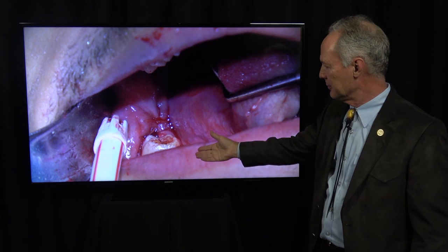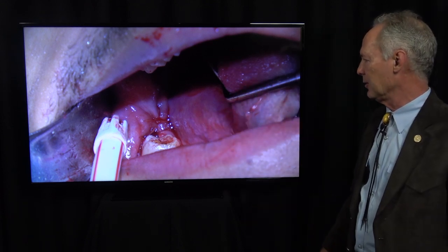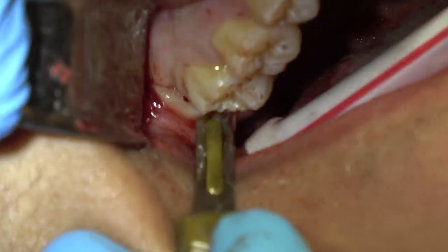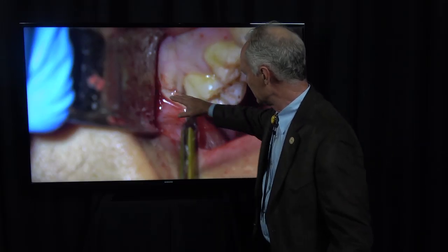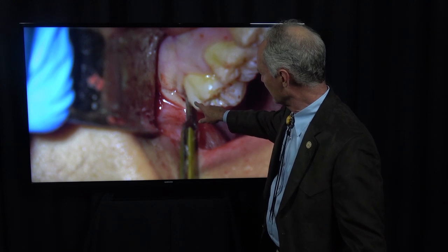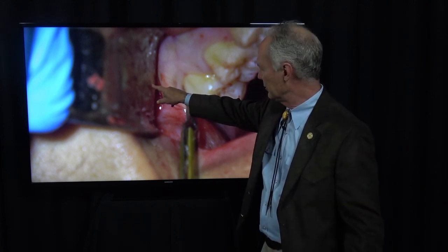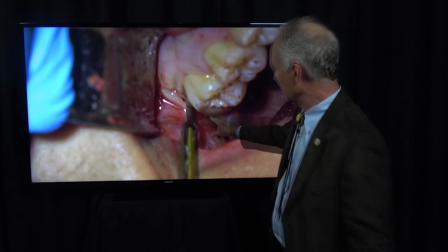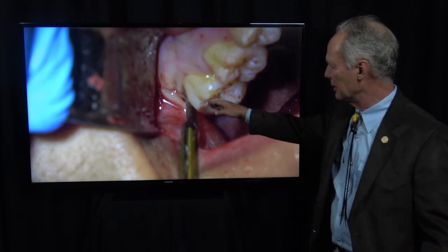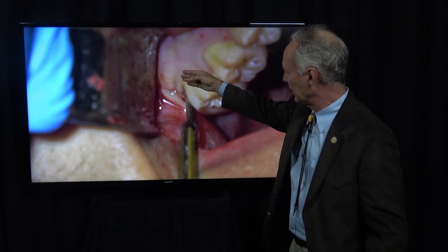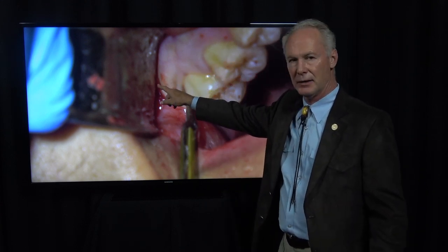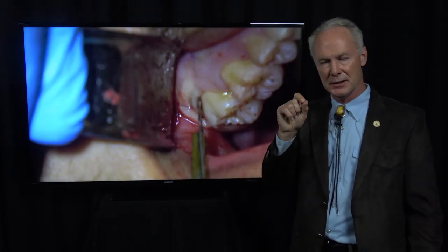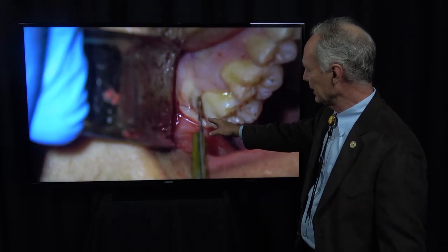Gravity is working against you on the bottom, because you can get food debris in the lower extraction sites. Here's the upper right wisdom tooth. You make one vertical incision from the distal buccal of the second molar apically into the non-attached, non-keratinized gingiva, and then an incision across the distal of the second molar. You can reflect this flap — and if you have a pretty impacted wisdom tooth, reflecting from further forward gives you more access. Remember, the bone is softer in the maxilla, so these are normally easier to extract.